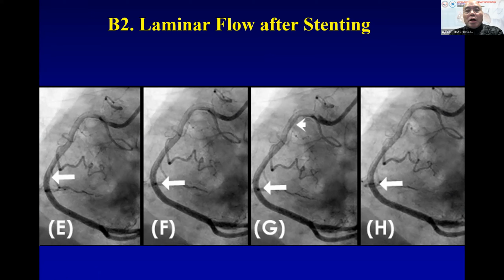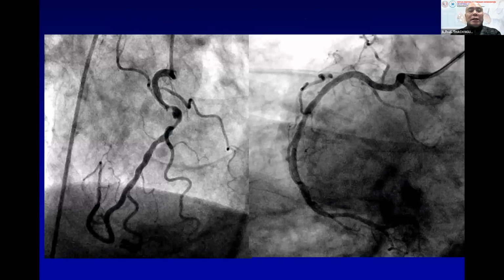In the talk of Gotham, you mentioned, did we restore the iFR to the normal level? The iFR formula is the distal pressure over the proximal pressure. If the flow is fast and good, that means the pressure drop is low. So the laminar flow can be a surrogate metric for pressure. Okay, so this is what I'm doing in research.